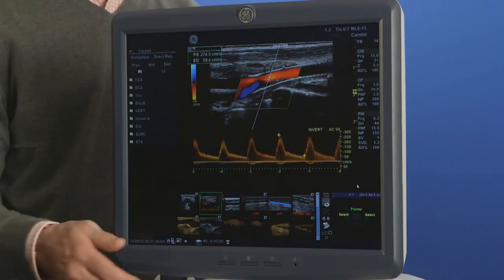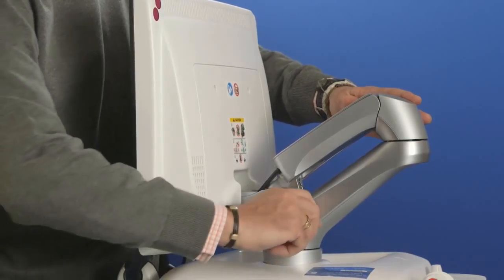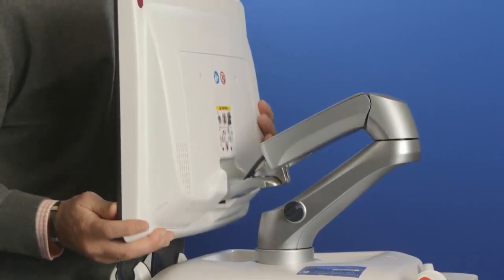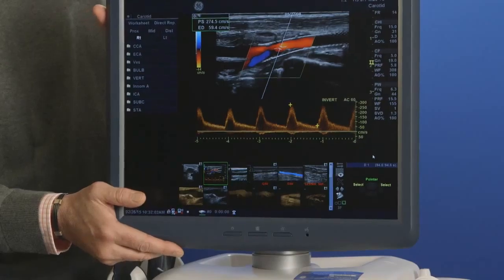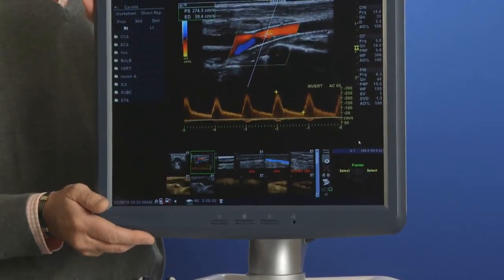The CD/DVD drive is located on the right side of the system, near the probe ports. Use the CD/DVD player button to open when the drive is empty. When a disk is in the drive, however, you must eject it properly using the F3 key on the keyboard. Video clips and images can be written to the CD/DVD drive using this device.